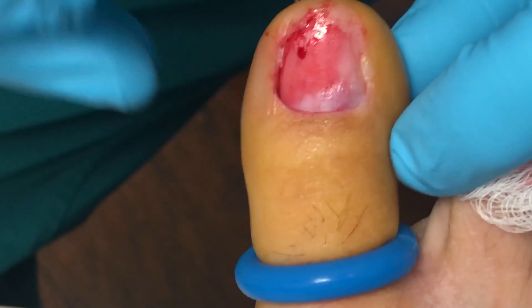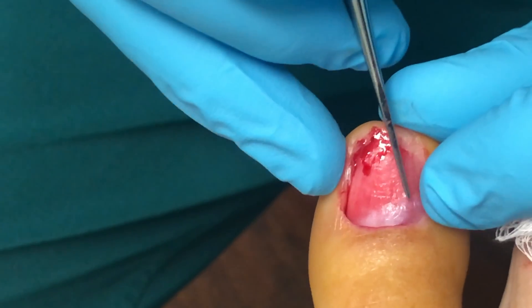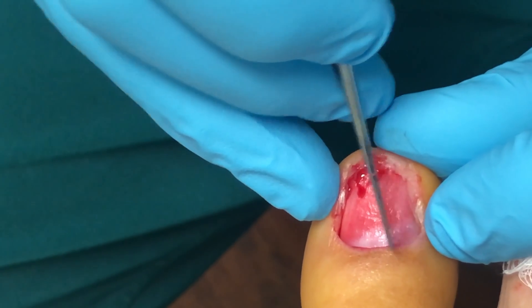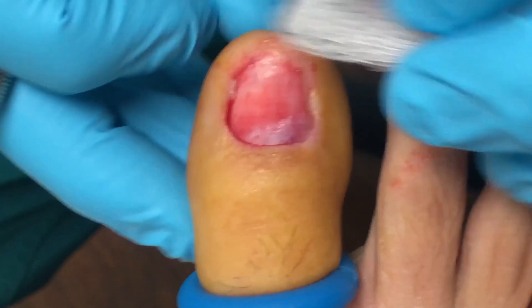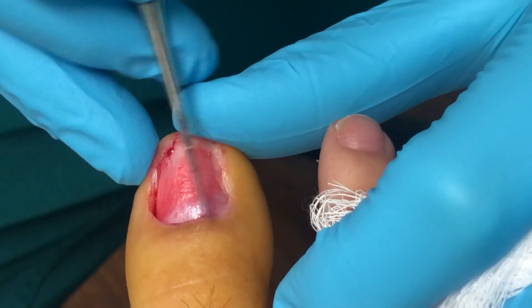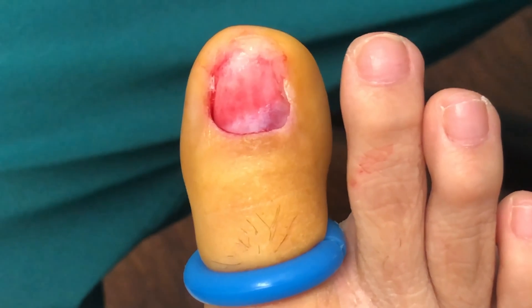So you can see a little bit better now, nice and clean. You can kind of see this area right here. So we'll kind of ellipse it, cut it out, send it for pathology. The big thing we talked to her about is it may potentially impact the way the new nail grows back because of where it is. So let's get the blade.